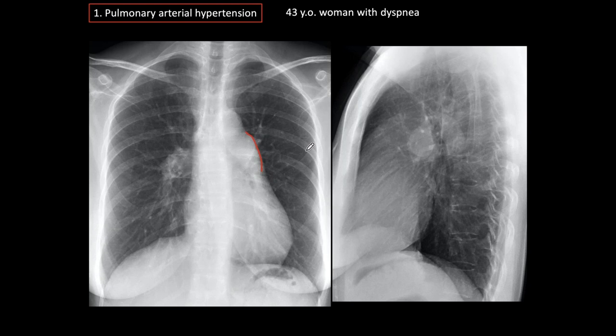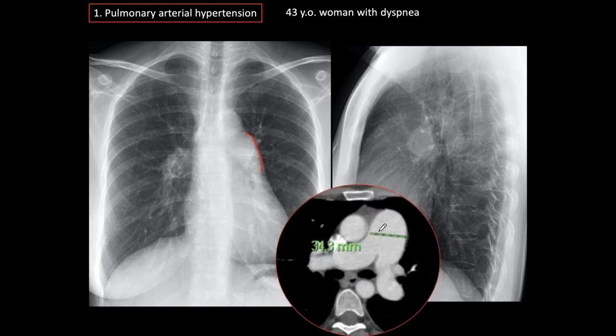This is one of the most common conditions we are going to find on the plain film when we see convexity of the pulmonary artery segment. This is the CT of the patient showing the disparity between the size of the aorta and the size of the pulmonary artery, which measures almost 35 millimeters. The maximum normal diameter of the pulmonary artery is 29 millimeters before we call it abnormal.